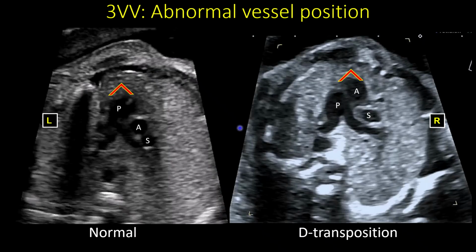So what's important about this view is that we can see the position of these arteries in this three-vessel view, and we can see that the pulmonary artery, again, is most anterior in the chest, where you have the SVC here on the right. The aorta is next, on the right of the pulmonary artery, but next to the SVC, and then the pulmonary artery, again, is more anterior, a slightly bigger main pulmonary artery than the aorta in a normal situation.